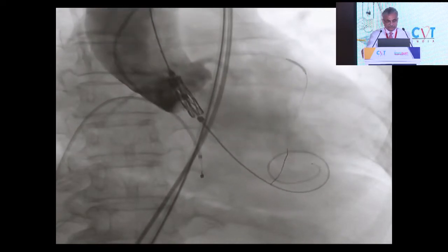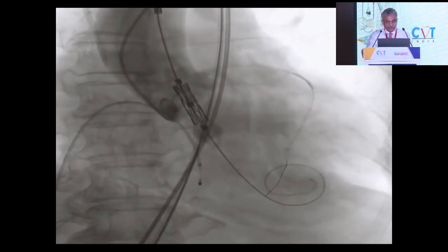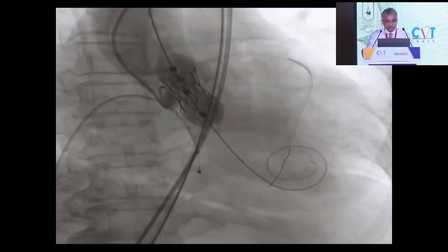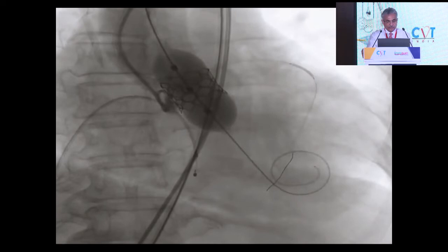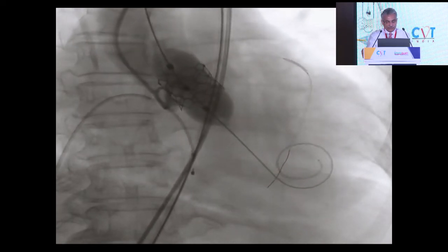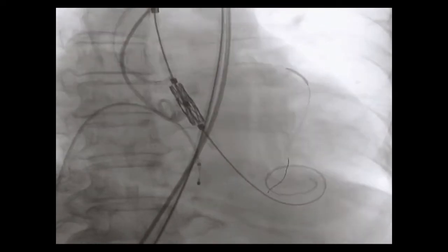That's the placement of the valve. We go very slow initially, and then go up and up. It was a 21.5 valve with 2 cc extra. On deployment, things were fine. The patient was very stable at that time.